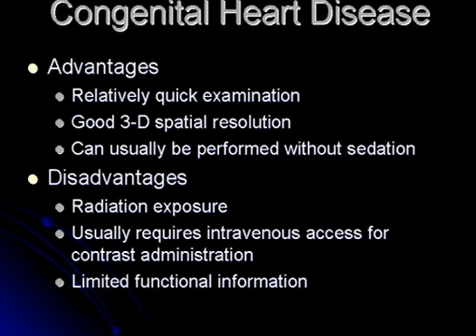However, there are disadvantages, including radiation exposure, the use of contrast requiring intravenous access, and in addition, there is limited functional information because of the limited temporal resolution of CT imaging.